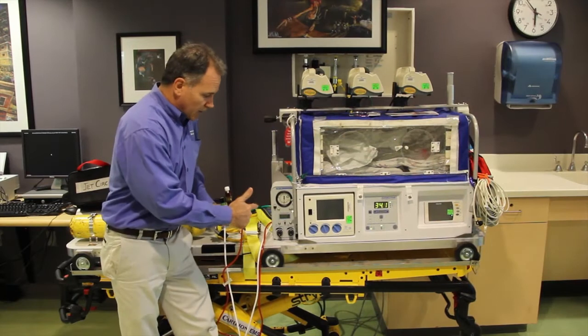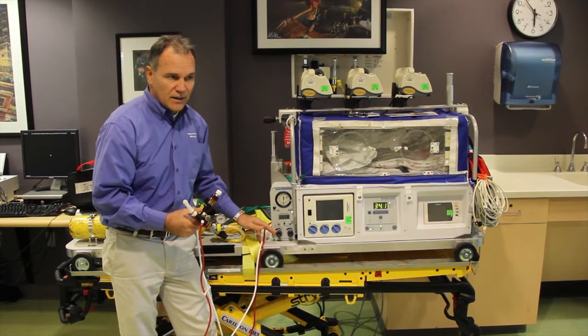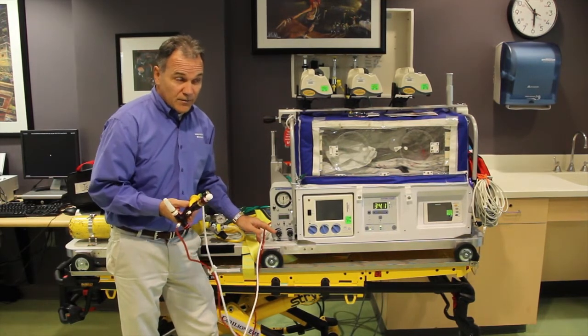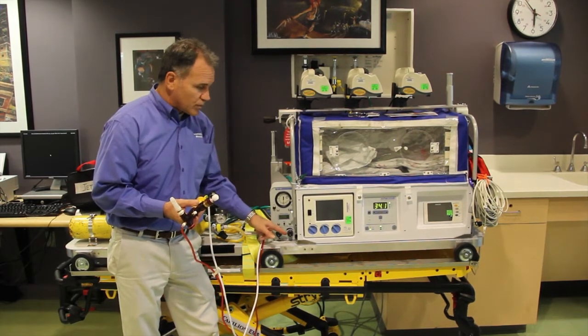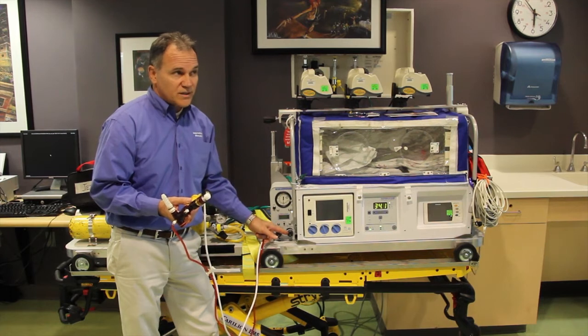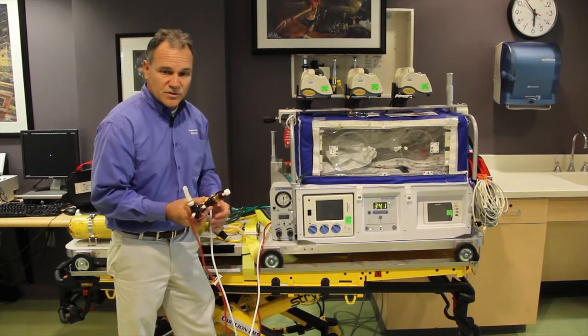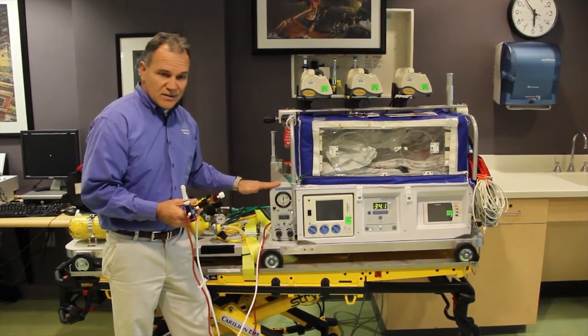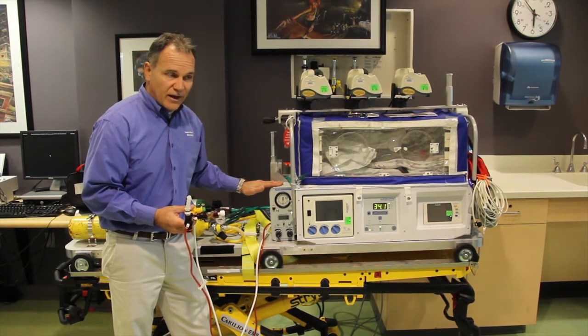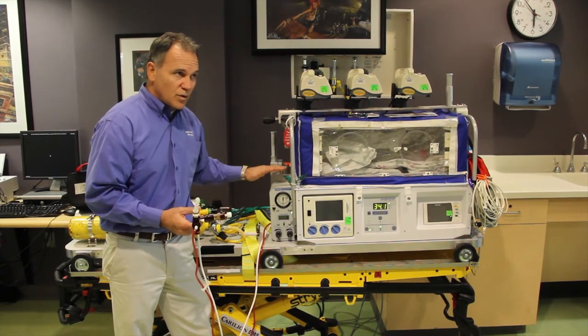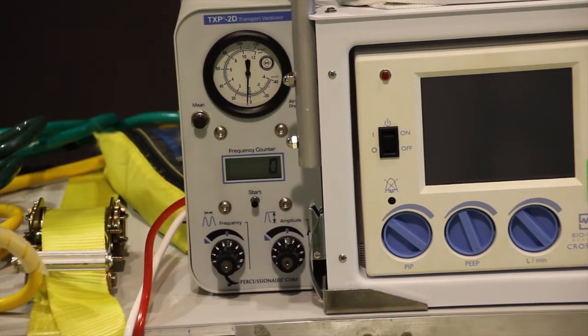I'm going to give you a scenario where we're going to take a patient off an oscillator and convert them over to the TXP. If they're on an oscillator with a Hertz of about 10, a Hertz of 10 would be a rate of 600. To convert them over here, we'll typically drop the rate down by maybe 25 to 30 percent, because the difference between this device and the oscillator is this has passive exhalation as opposed to the oscillator having active exhalation. So we want to slow the rate down to give the patient time to exhale.